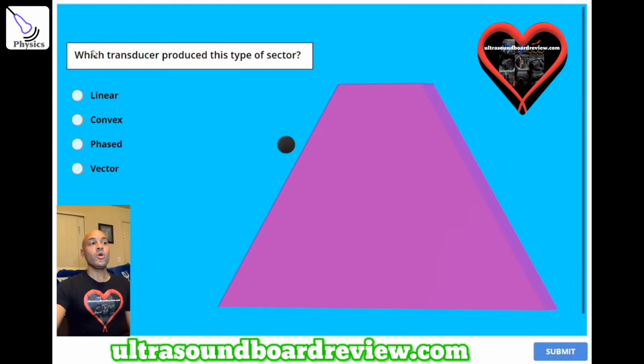Question number 14. Which transducer produced this type of sector? A. Linear, B. Convex, C. Phased, or D. Vector?